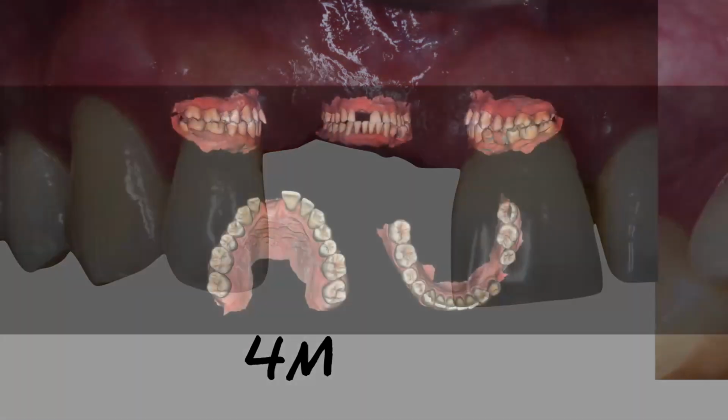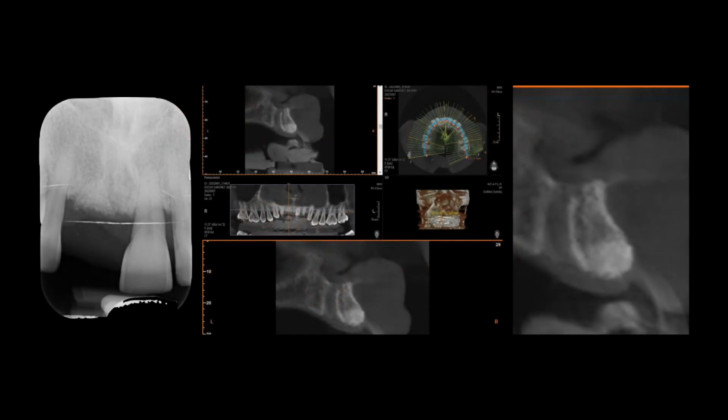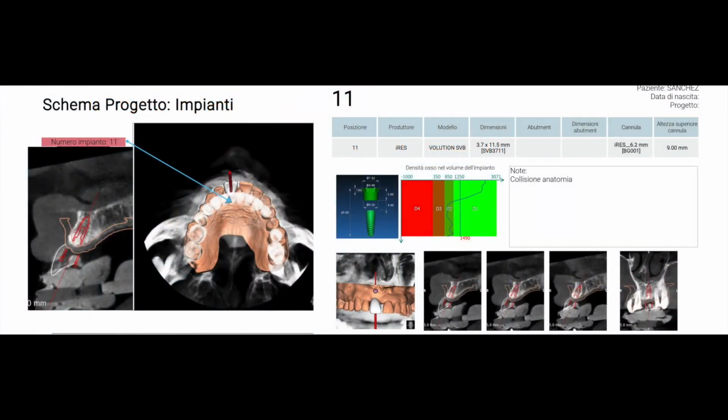We have increased volume and quality of soft tissue with a new presence of keratinized tissue in width and thickness, and we have not lost the verticality of the tissue. Actually, we have definitely increased. After taking a digital impression with an optical scanner, we can go then to organize the guided surgery with new horizontal GBR plus increase of soft tissue with connective tissue graft.